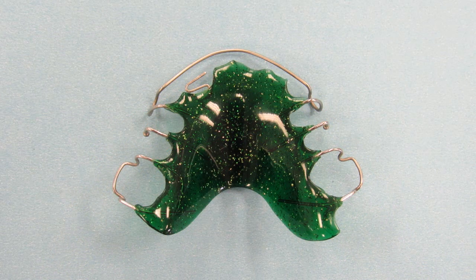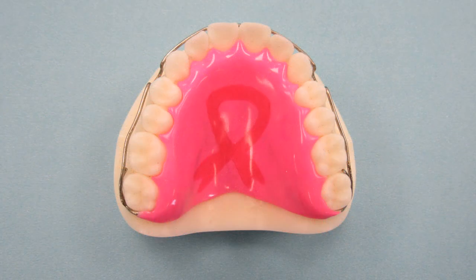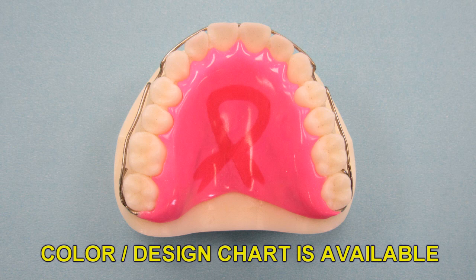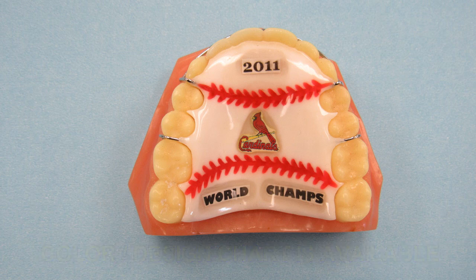There are a couple of tips you may want to utilize for your final retainers. One is colored acrylic or the addition of designs for all removable retainers. All removable retainers are fabricated in tissue pink acrylic unless you request something different. We have many different colors and designs available for your patients to choose from. This is an excellent practice builder and it may improve the way your patients take care of their retainers. A complete color and design chart is available upon request. Your patients will love their custom fabricated retainer and show them to all their friends.